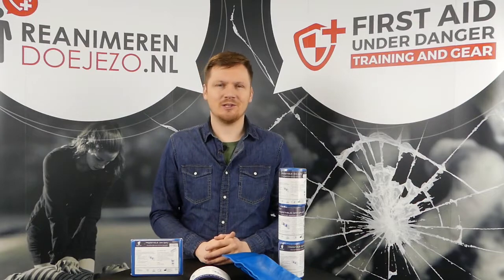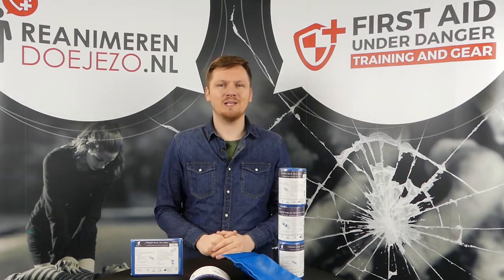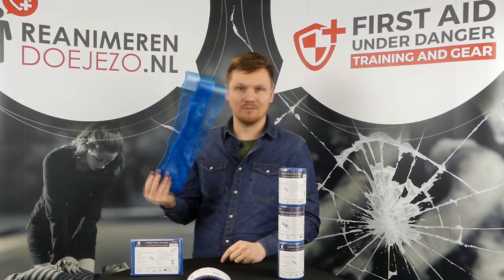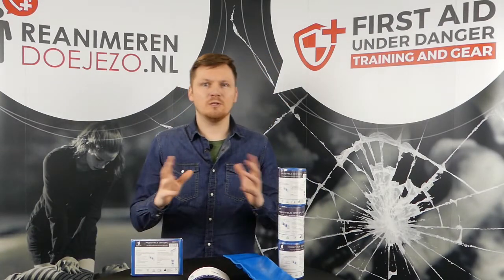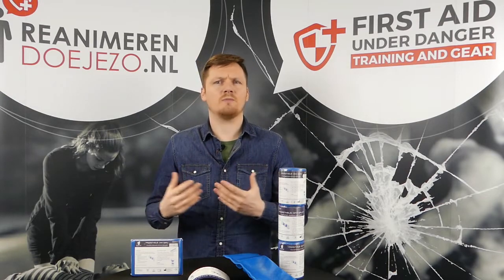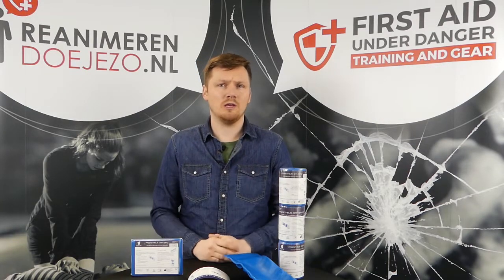Hi everybody and welcome to the First Aid Under Danger YouTube channel. My name is Niks Genkeveld and today I want to talk about the Omni Splint. The Omni Splint is just a different brand of splint — most of you might know the Sam Splint.